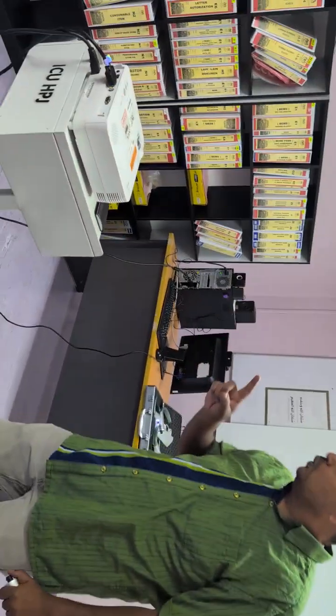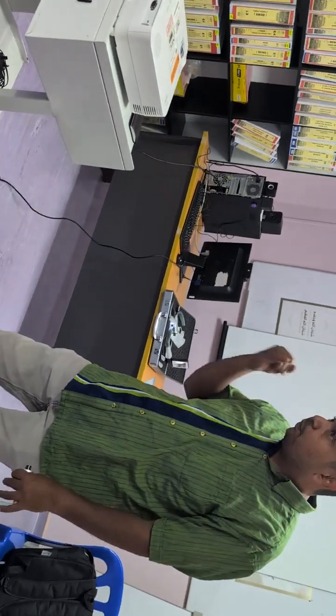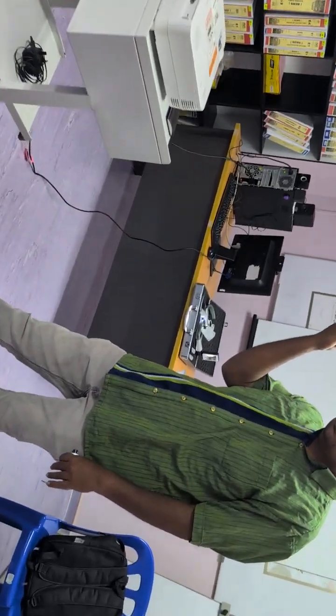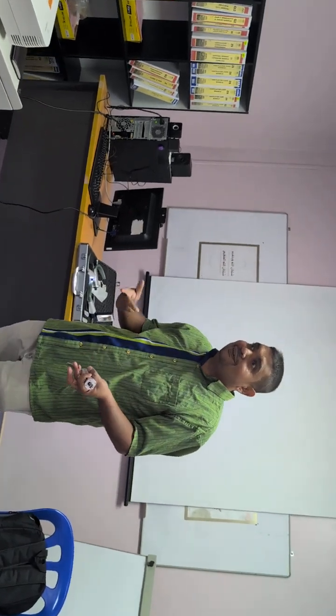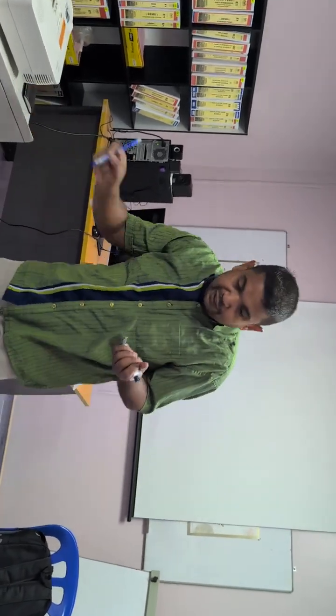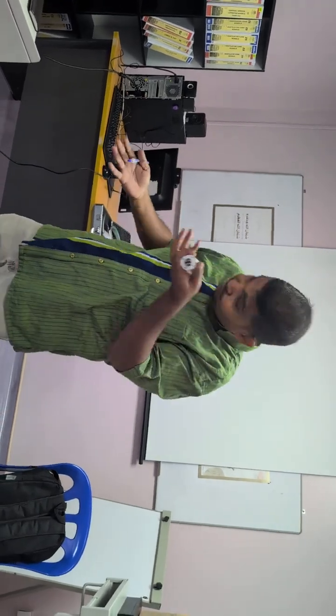Non-alcohol wipe. Do not use alcohol wipe. Reason, biofilm formation. When biofilm formation happens, the view is going to go kaput in the long term. And when biofilm formation happens, how does the anti-fogging mechanism work? Anti-fogging mechanism works via heating. And if the biofilm sits in front here, how is it going to get heated up? So there's no way, you're not going to see anything. Might as well you just go blindly.